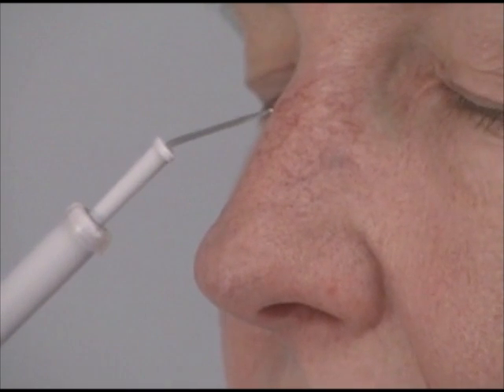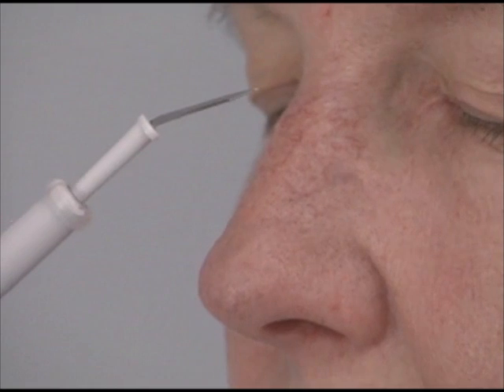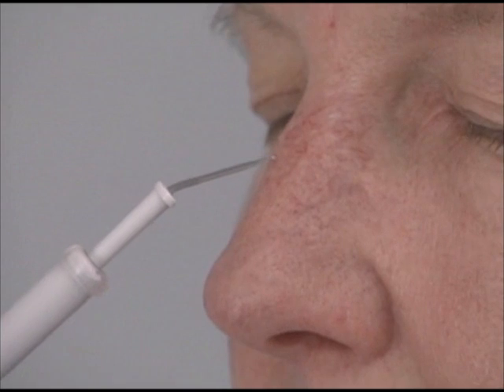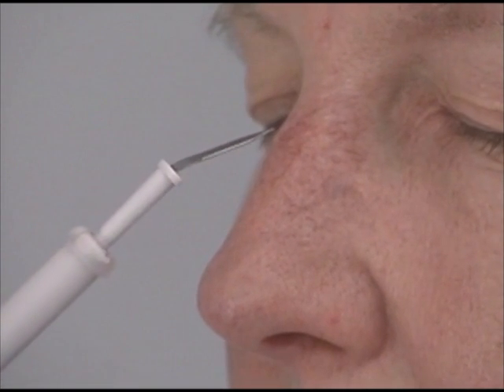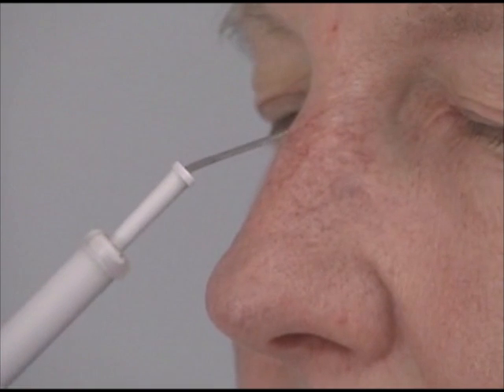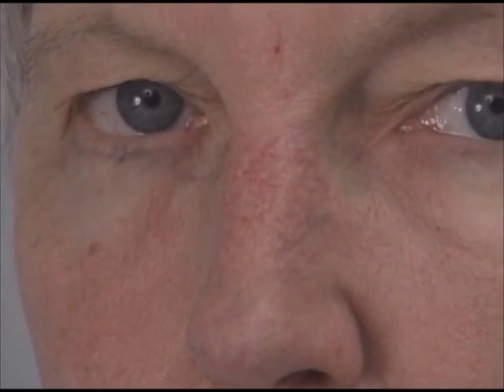We use the sharp electrode to treat facial telangiectasias. Touch the electrode to the most central vessel and compress the vessel before activating the electrode. A short burst of power at approximately 2 watts is adequate. It is helpful to warn the patient before touching the electrode to the skin so that the patient is prepared for the sharp sensation. Once the vessel is compressed with the electrode, electricity can be transmitted for about a second. When there are many telangiectasias, it is helpful to test this procedure out on a few of the vessels and let the patient decide whether additional treatments are desired. Tearing of the eyes may occur as a reaction to the treatment near the eyes. The vessels are currently less prominent and you can see little whitish spots where the electrode was activated. The white spots are small and superficial so that there should be minimal to no scarring from this procedure.